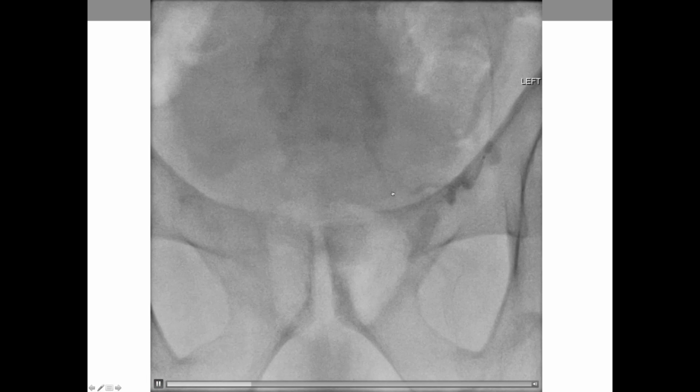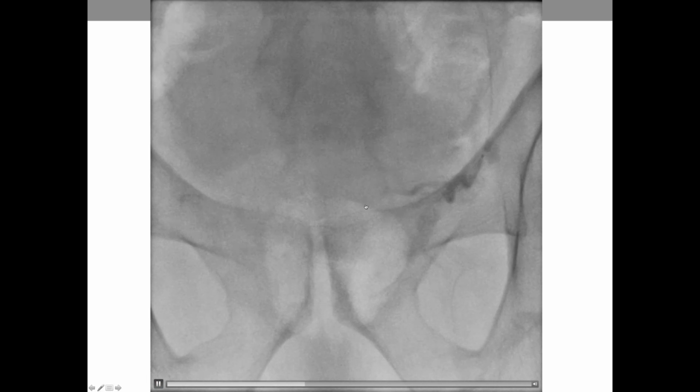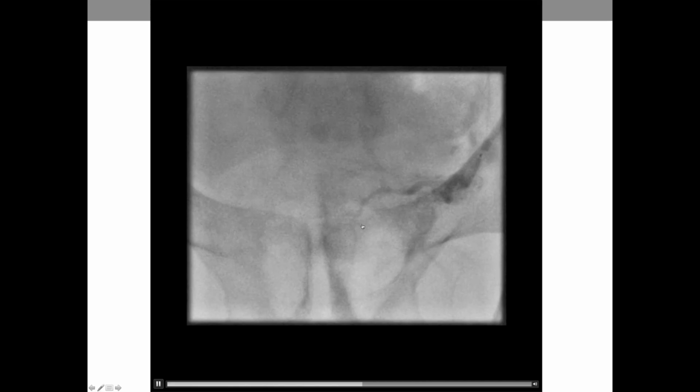We're seeing it go forward and back, and eventually it's embolizing the prostate, so the pressure here is increasing. And at some point, the pressure here is going to equalize the pressure coming up, and then we will reach a kind of stasis. We'll reach stasis within this area.